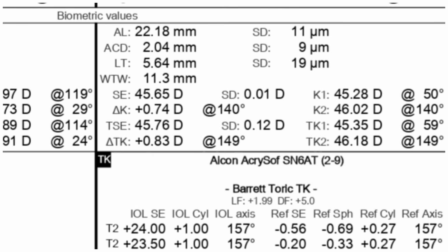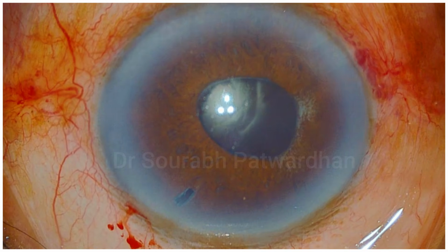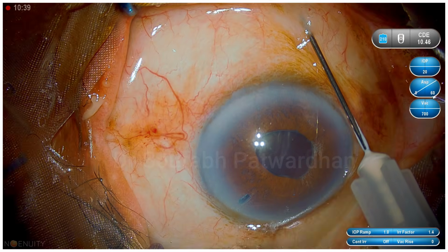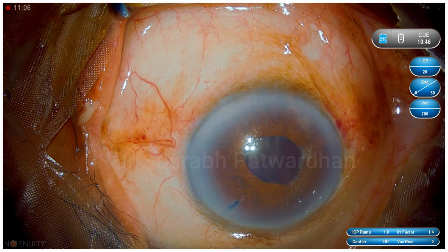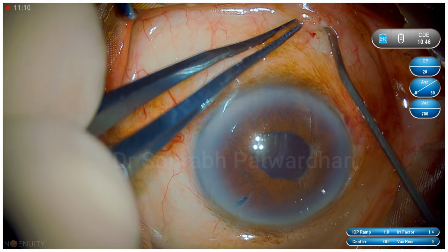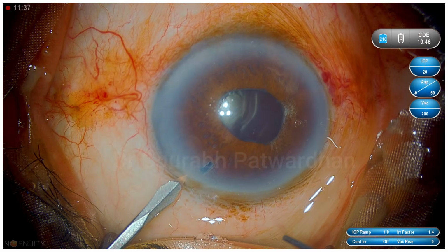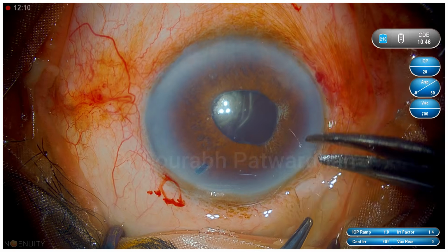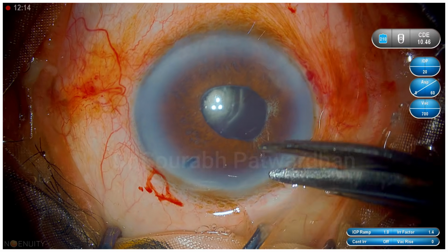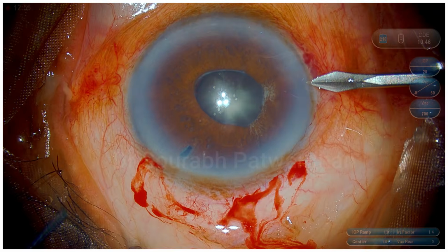You can see the lens thickness is 5.64, and when you look at the cataract, it's a dense black cataract, and you can see the pupil is fibrotic. It's a non-dilating pupil. You can see that PI or peripheral iridectomy has been already done, indicating that it's a case of chronic angle closure. And this patient has waited for a long time. Patient has lost the other eye to glaucoma and advanced cataract, and now the patient wants to get this eye operated.